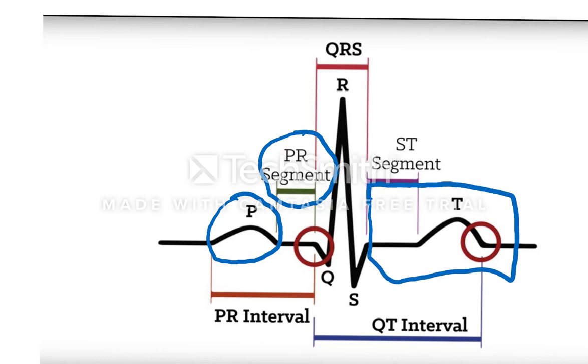So let's review some general rules. If the QRS is wider than expected for age, this often represents disease in the conduction system, or the conduction is occurring outside of the usual His-Purkinje system. Think of the His-Purkinje system as a highway and the myocardium as the back streets. The electricity can shoot down the highway at high speeds, but when it gets on the back roads, it has to slow down for cell-to-cell conduction one at a time. Since the cell-to-cell conduction is slower, this will lengthen your QRS complex, giving the EKG the appearance of a wide QRS. So if you have a wide QRS complex, that implies that the ventricular myocardium is not being depolarized in the usual way down the His-Purkinje system, and is actually proceeding with cell-to-cell depolarization outside of that system.